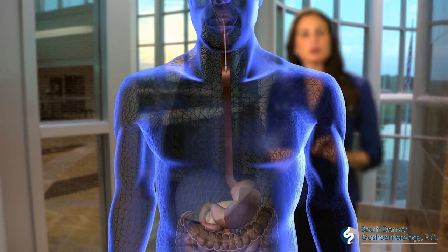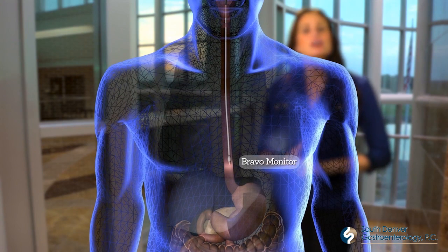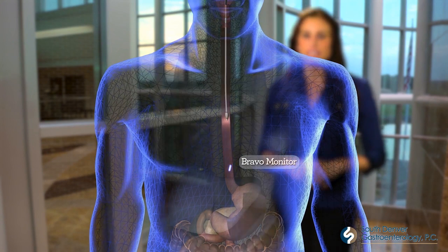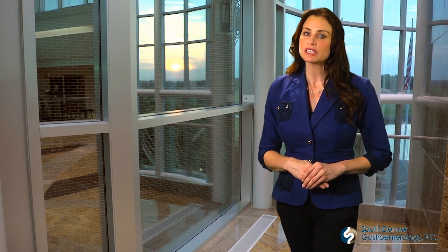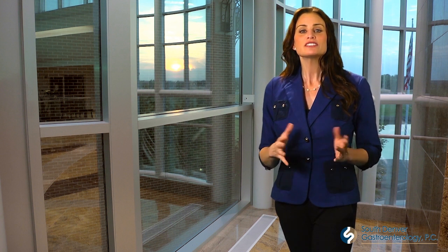Your doctor may treat any abnormalities seen during the exam. If a stricture or narrowing of the esophagus is present, a dilator could be used to stretch the area. Samples of tissues, digestive fluid samples, biopsies, or cultures may be taken during the exam. If indicated, a small acid monitor, a Bravo capsule, may be placed to measure acid in the esophagus. If a polyp is discovered, your doctor may remove it using a snare or biopsy forceps inserted through the endoscope. Because your GI tract can be seen so clearly, doctors can determine if further testing will be needed and develop a treatment plan for your diagnosed condition.